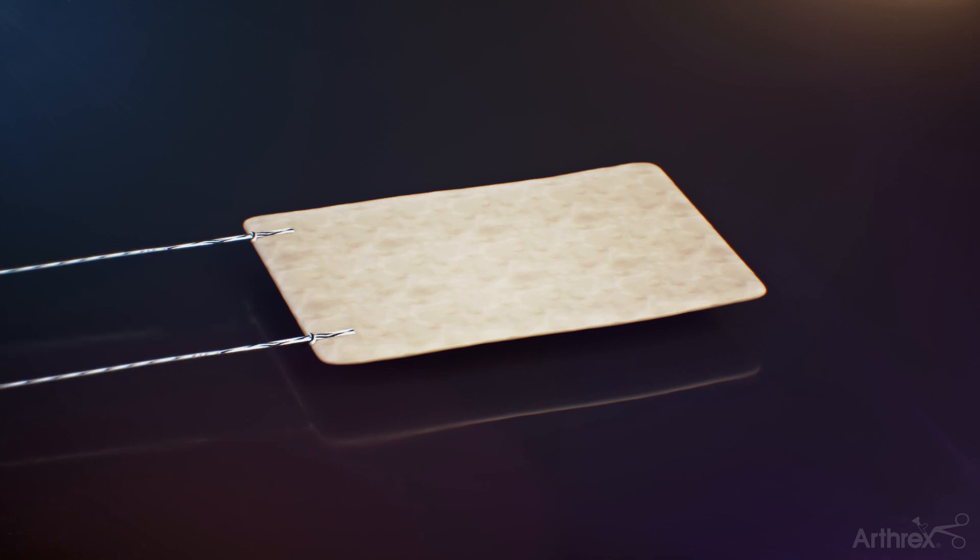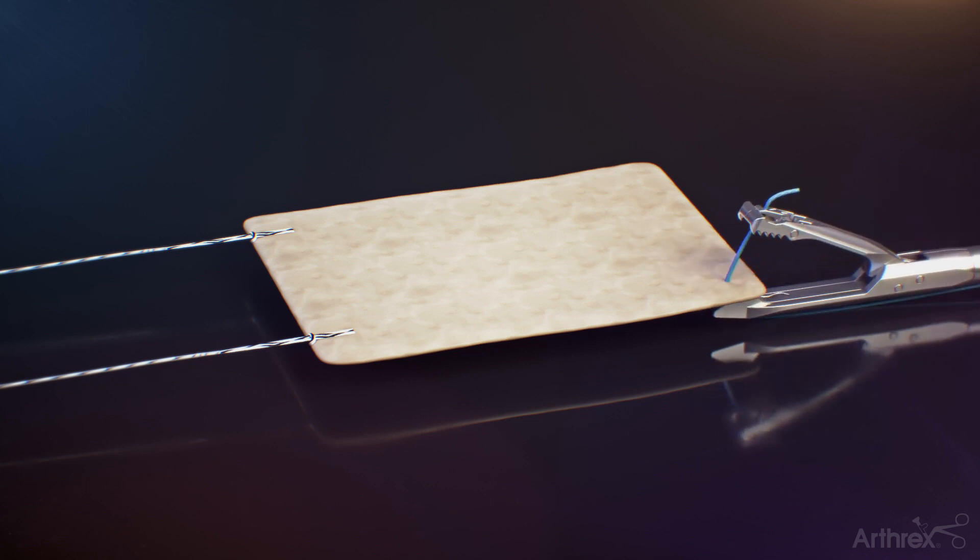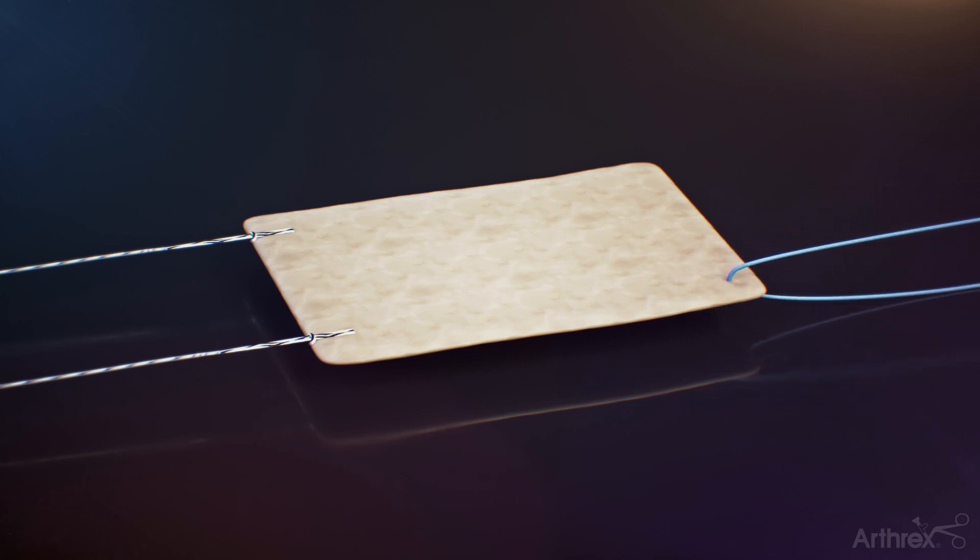Load the number zero fiber wire into the Scorpion Suture Passer and pass the suture through the medial corner of the graft. Repeat for the second medial suture placement.